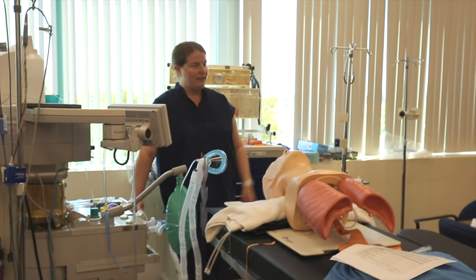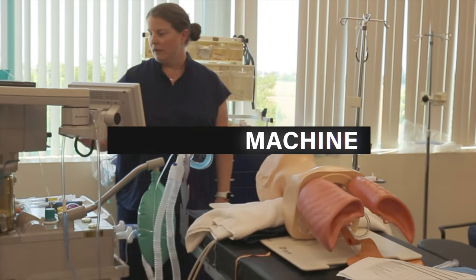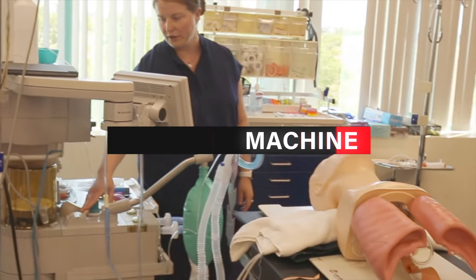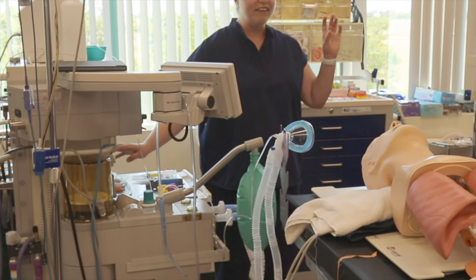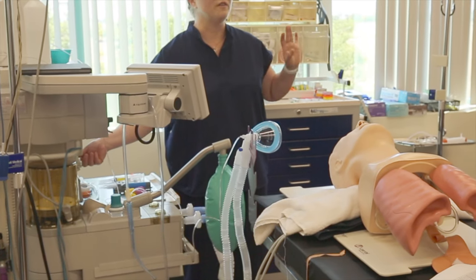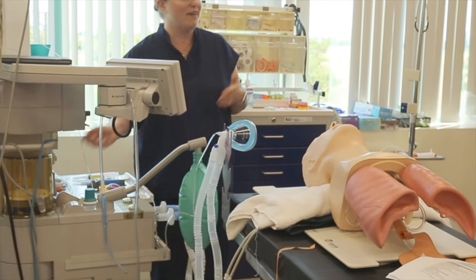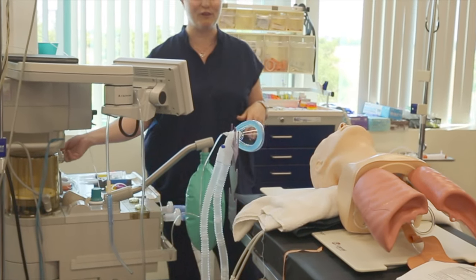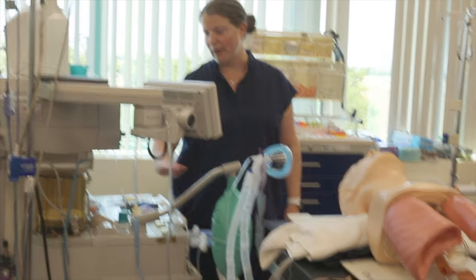So that's airway. The first M is for machine. The machine needs to be turned on. You want to make sure your APL is open, that you're in bag mode, your vaporizers are off, your O2 flow is off. Little caveat, asterisk situation here. Some providers will want you to just keep the FiO2 on all the time, so that you don't accidentally forget to turn the O2 on. If you have it on all the time, you at the very least know they're getting some, even low, flow of 100% FiO2. Anyways, but flow is off, APL open, bag mode.